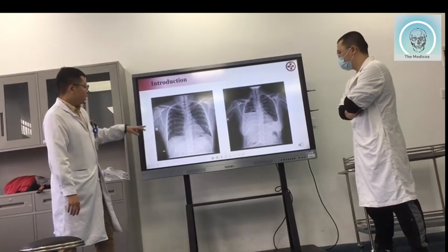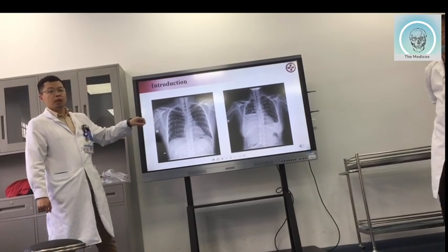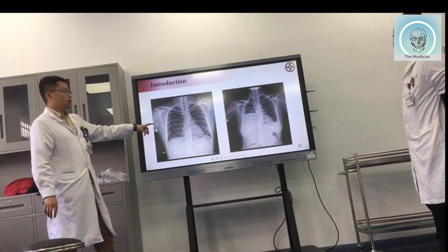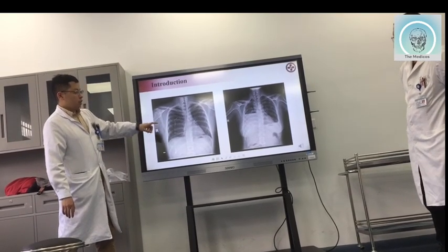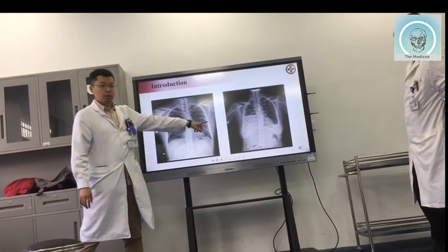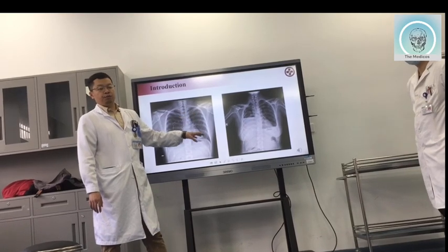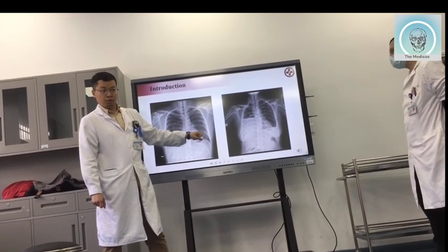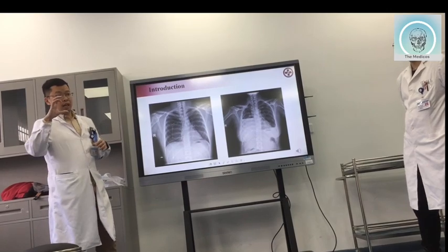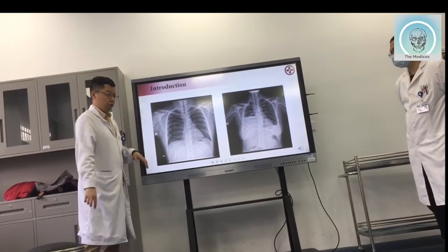So here we have this one. This is a daily use kind of small tube. But it's not for today. Today we will do the classic procedure. I will show you. You can see when you put a small tube inside of the chest cavity, then it will drain the gas off the side of the chest cavity. And this is for the fluid. Okay. So when you see there's a level, which means there's gas and fluid both inside of the chest cavity. Okay. Can you understand? Just like the water level, which means the upper side is the gas and the lower side is the fluid. So there will be this kind of line here, okay?